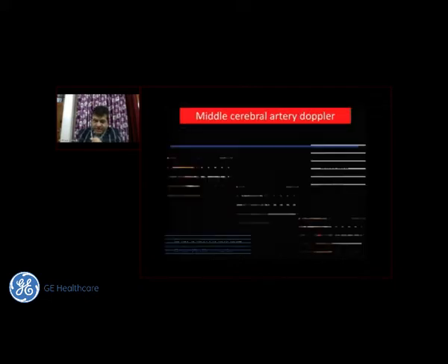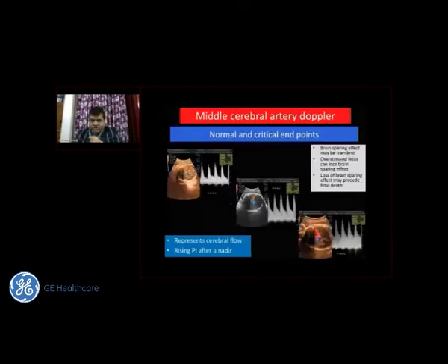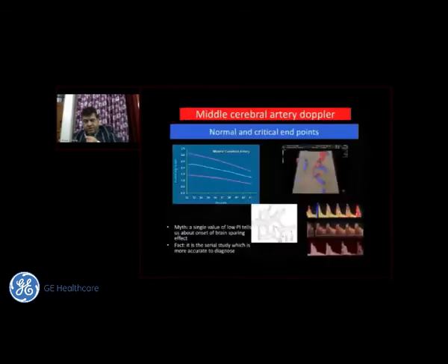Also, please remember that once brain sparing in the fetus sets in, then we need to look at other parameters to define when to terminate this pregnancy and what to do about this fetus. But at the same time, please remember the brain sparing effect may be transient. An overstressed fetus can lose brain sparing effects. Loss of brain sparing effect may precede fetal death. So therefore, we cannot be waiting for the brain sparing effect to disappear. We just need to interrogate the other Dopplers and then make our decisions.